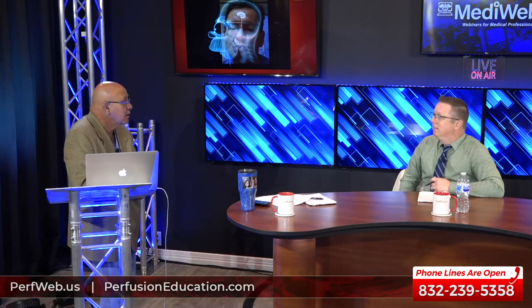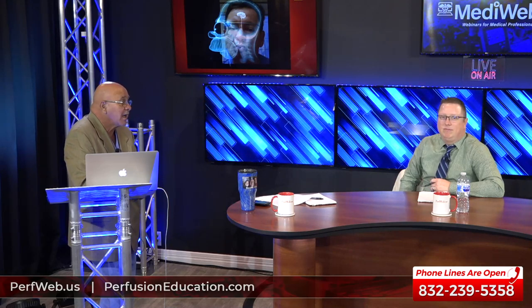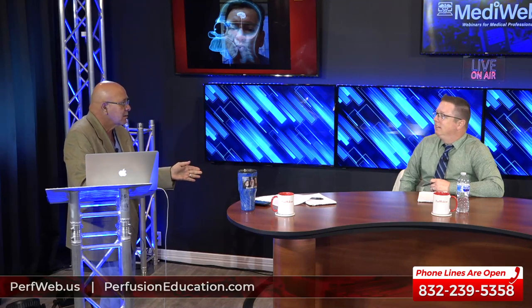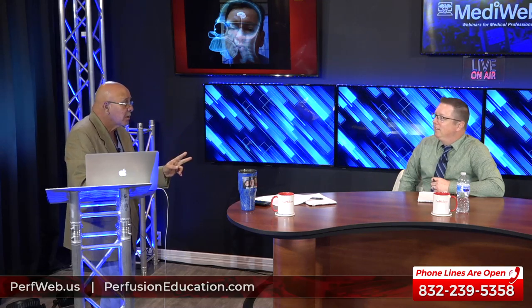I have a much better chance of giving those red cells back to the patient than if you put it over here. I turn the pump suckers off as soon as the protamine is in somebody's hand. As soon as I hear the P, before they get to the rest of the word, I've already got it off. I'm not doing this. I've had the pump clot off on me twice. You only have to have it happen once, but to have it happen twice in a career, I've been doing this a long time, you don't want that experience.